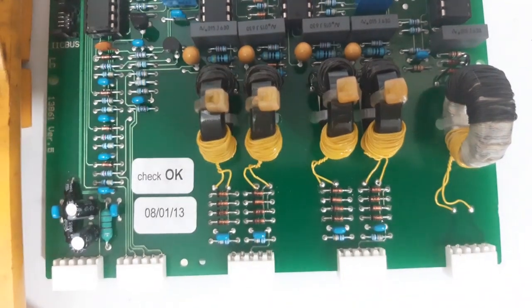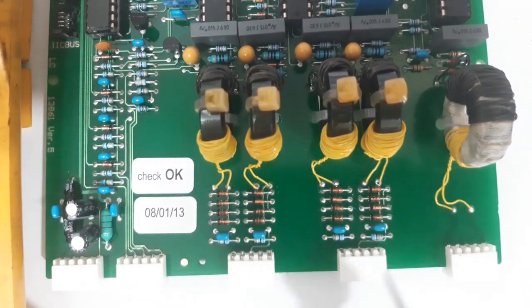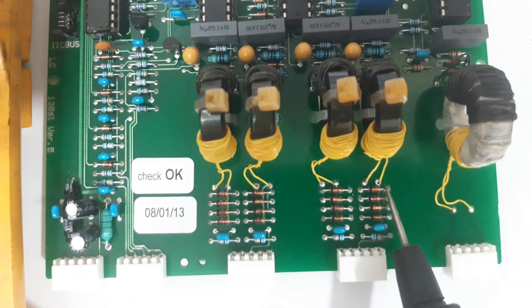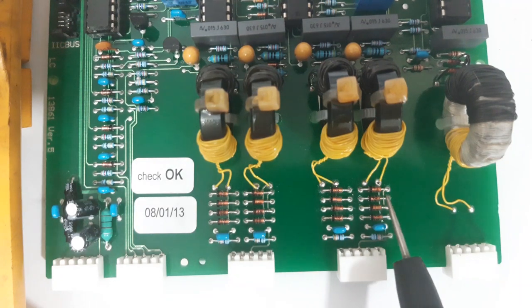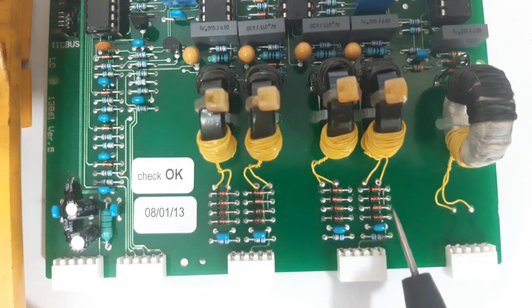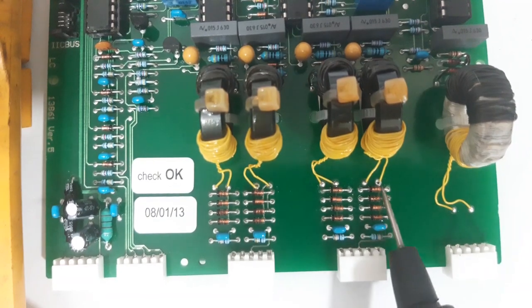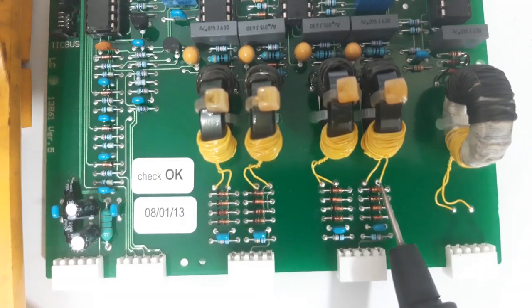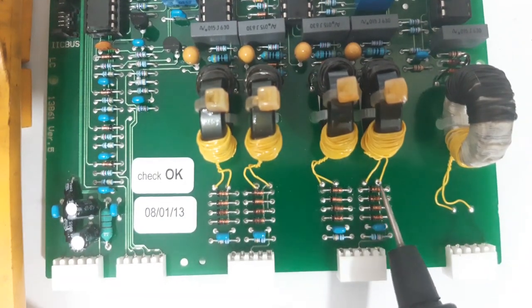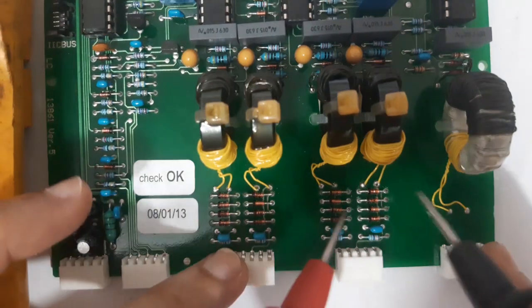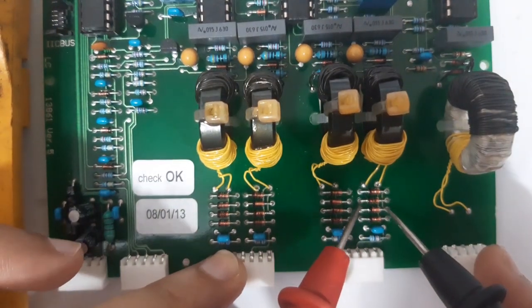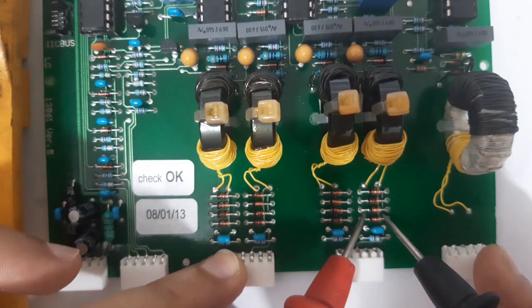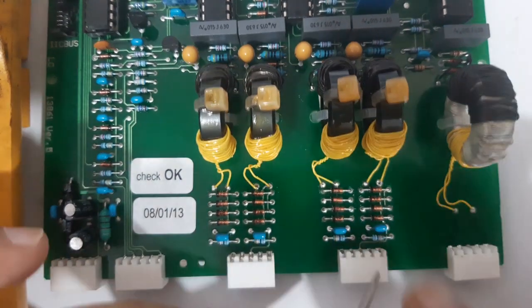Now if these diodes are in parallel, it doesn't mean that all of them are short. Maybe only one. In order to check that, we have to remove at least one pin of the diode so that we will know if they are all short or only a few of them are short.